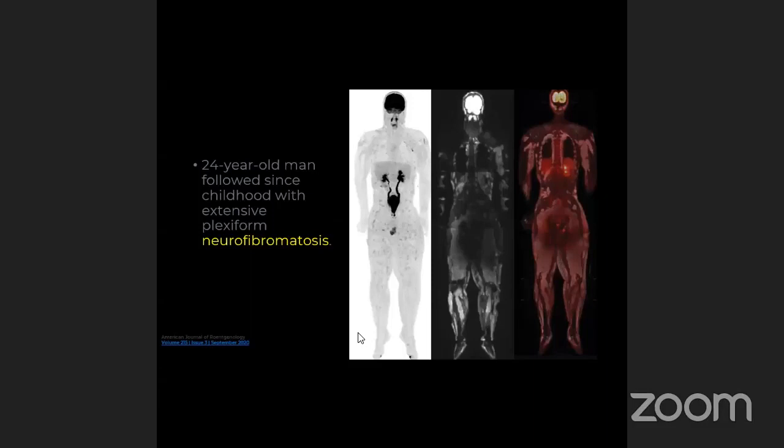Some of the diseases now, like NF, adding the PET in this patient is very beneficial. You can see this patient, they did MRI for him, and you can see in the MRI the benefit that you can detect the pattern easily, soft tissue lesions, plexiform neurofibromatosis, so you can know the pattern.